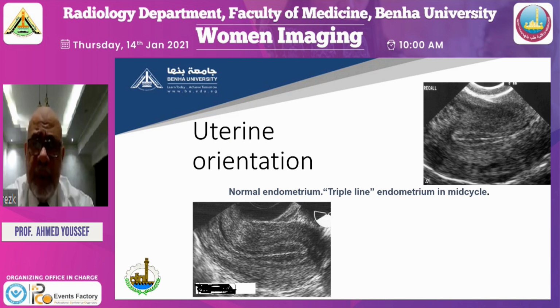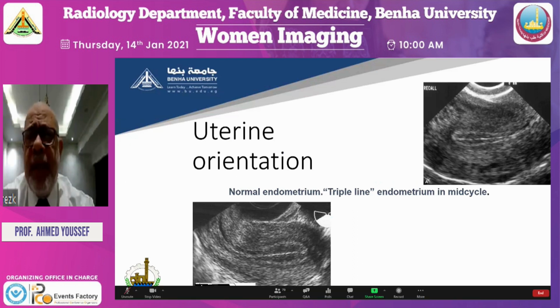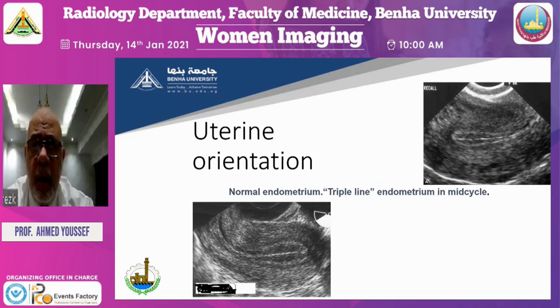And most of us use ultrasound as a tool now for the follow-up. Previously, we were accustomed to using the lab associated with the ultrasonic follow-up. I measured the progesterone on the day of the oocyte retrieval, but now we don't do that.